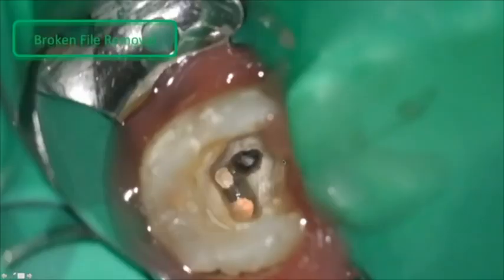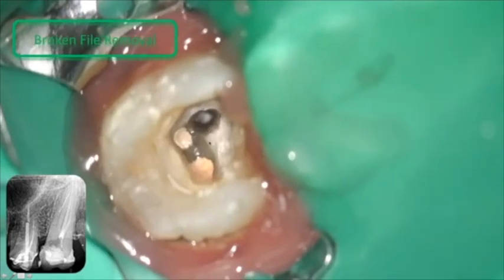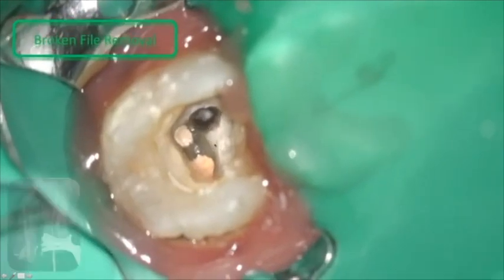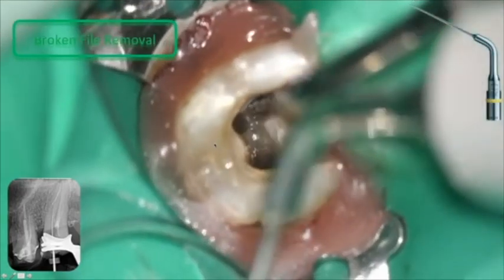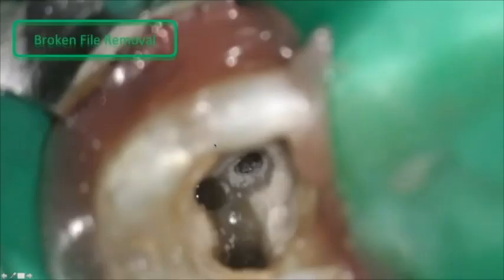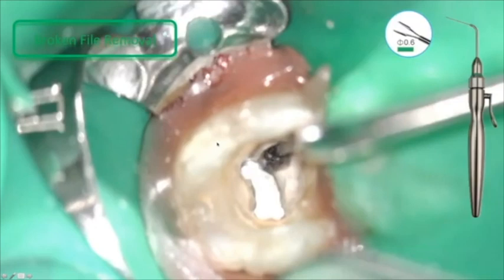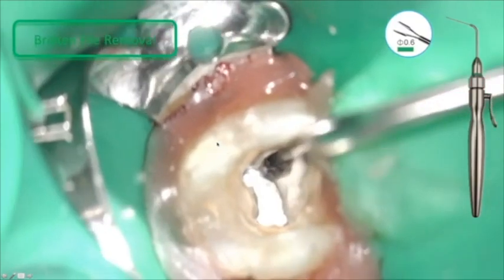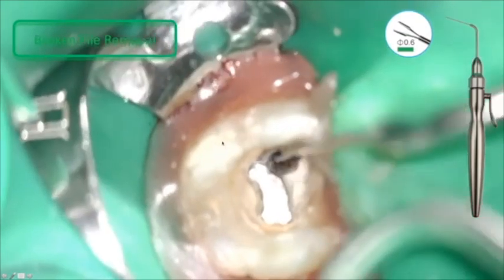So here, at the beginning, I'm just examining the access cavity at the 7. You can see the visibility here. I'm working on an upper second molar, and the visibility is very good. So I can try to see if I can see the instrument at first. I can see it. It's a stainless steel file. I try to grasp it with the Zoomax micro tweezer, and it's not catching.